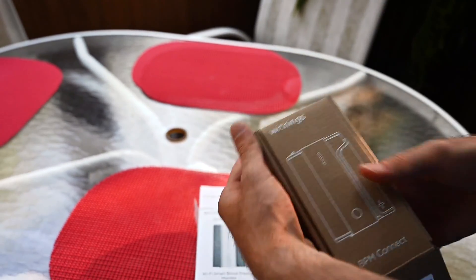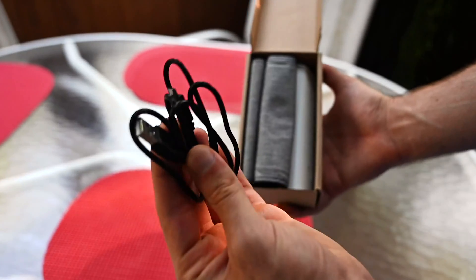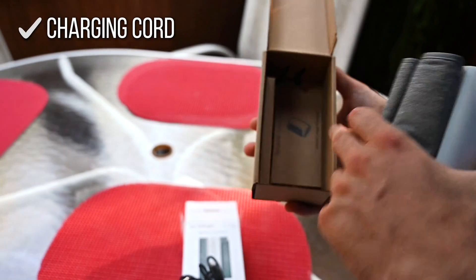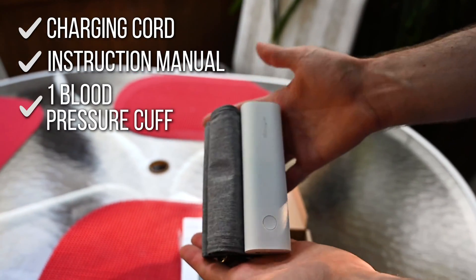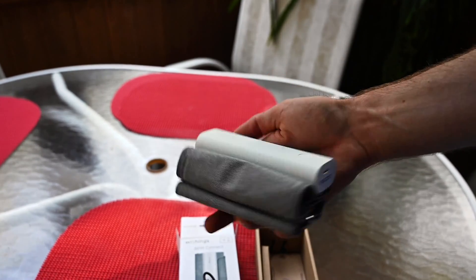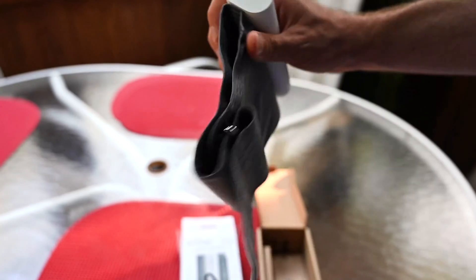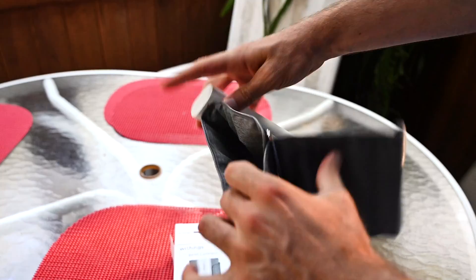Inside the box is the BPM Connect unit. Here is the charging cord — just a standard USB to micro. There's an instruction manual in here; you should always read the instructions. The actual unit is about the size of my hand, so it's super compact. It expands out, as you'd expect, into a normal blood pressure cuff, and you can obviously adjust the size as needed.